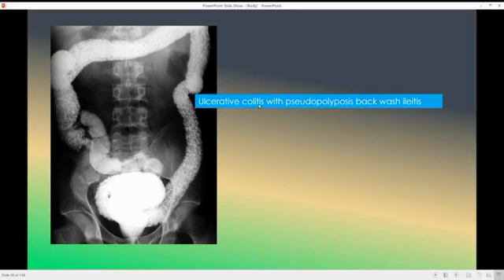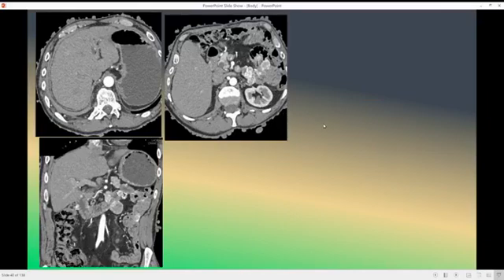We move to the next case. What do you think of the next case? Maybe this is a difficult case, but you are very good and you will answer the case.